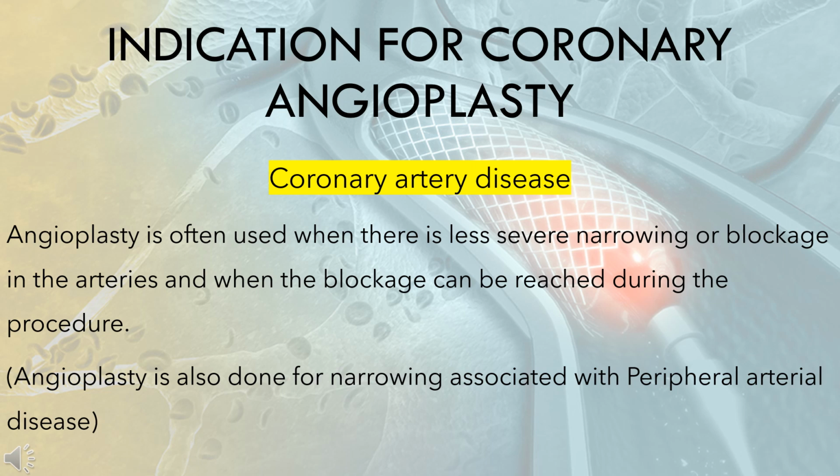The major indication for coronary angioplasty is coronary artery disease, and coronary angioplasty is often used when there is less severe narrowing or blockage in the arteries and when the blockage can be reached during the procedure. Angioplasty is also done for narrowing associated with peripheral arterial disease.